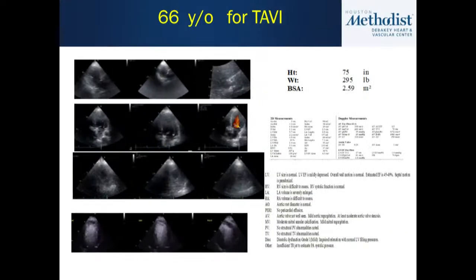Okay, moving on to CT. Why even bother with CT? So this is just an example of a patient for TAVR, and echo EF is called 45 to 49%, but the confidence is probably low, you've got a lot of guessing. And with motion, forget about it, right? You can do MRI, obviously, but since the patient definitely has a severe AS.